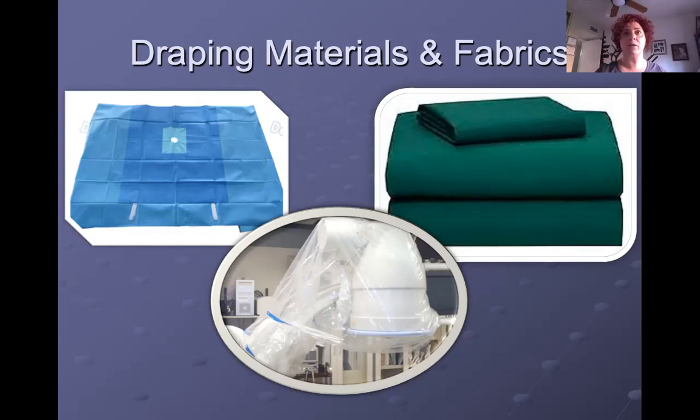The second type is over here, and these are fabric ones, or woven materials, okay? And this is like your bed sheets at home, except they're a really high thread count. So that increases their resistance to strike through, okay? They are also chemically treated with some stuff that's supposed to further increase their impermeability, their imperviousness.